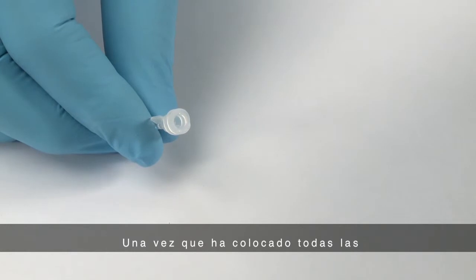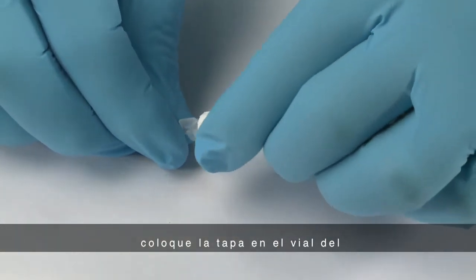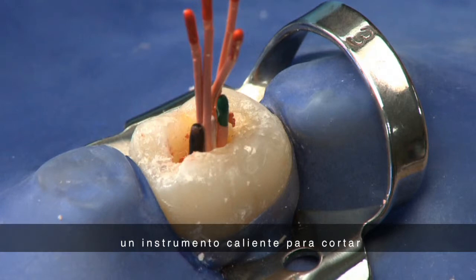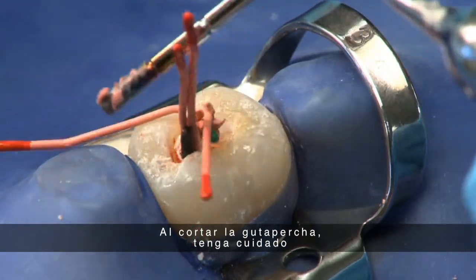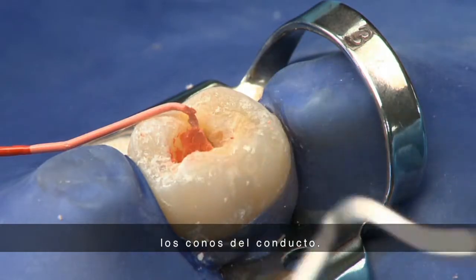Once you have placed all of the gutta percha points that you desire, replace the cap on the EndoREZ Accelerator vial and dispose of the vial. After 5 minutes have elapsed, test the set of the sealer, then use a heated instrument or searing device to trim the excess gutta percha. When trimming the gutta percha, take care that you don't inadvertently dislodge the cones from the canal.